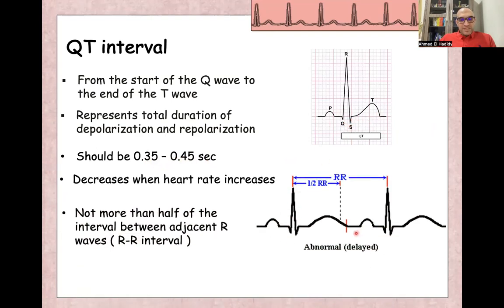And normal estimation for the QT interval, it should be less than half the distance between RR interval. So normally it's less than half the distance. If it exceeds half the RR interval, so this is prolonged or delayed QT interval. So here this is the normal and because it's less than half the RR interval, if exceeds half the interval.